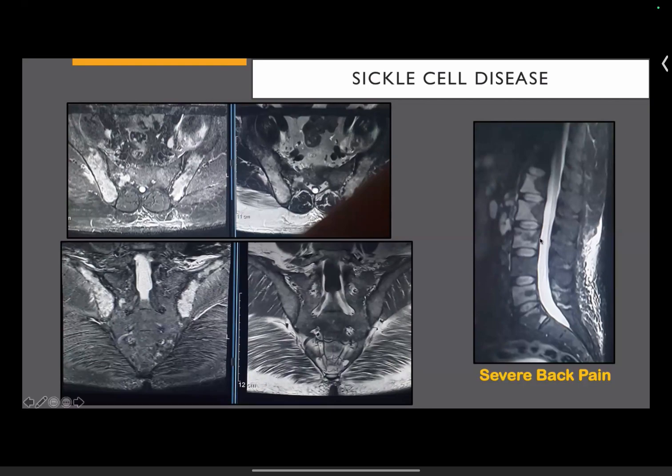If this is an MR I'm reporting without a history, I'll probably put infarct in the differential, but metastasis will be my concern. But if I know this patient has sickle cell disease, has worsening pain, and I've got a previous MR which showed nothing, or a few areas, and now there are new areas, it's a judgment call. That's where your rapport with the clinician comes into play, and you have to discuss with them. And when not sure, you either go for follow-up or go for biopsy. Sometimes we don't have the answer, so we just have to play safe.